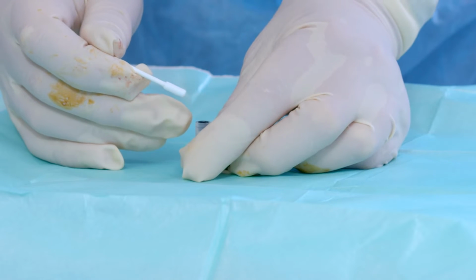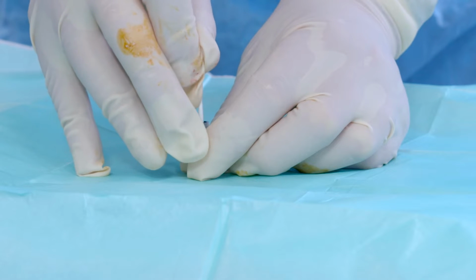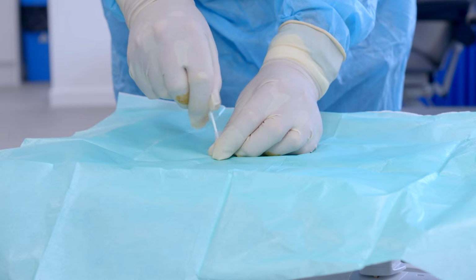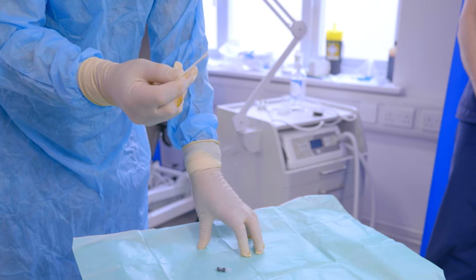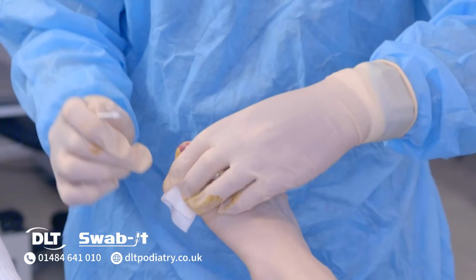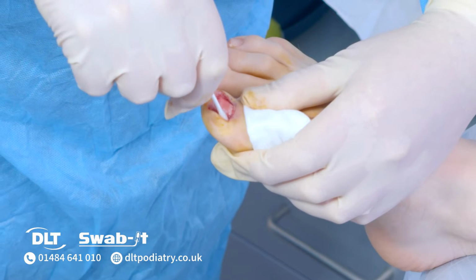To use it, you have to keep the ampule vertical. You take the applicator and you can feel resistance as you gently push. You have to break that resistance to access the phenol. And then you move the applicator backwards and forwards a few times so that the swab absorbs the phenol. Some people protect the surrounding tissues with petroleum jelly. I just tend to use a swab just in case I need it for any excess phenol.